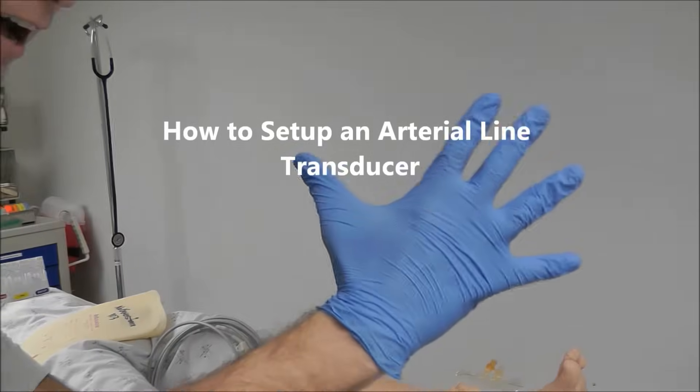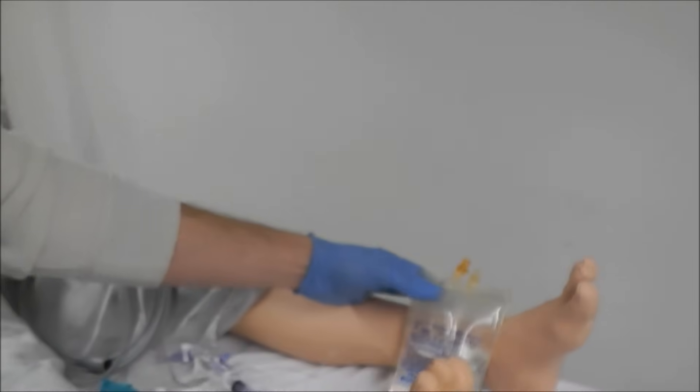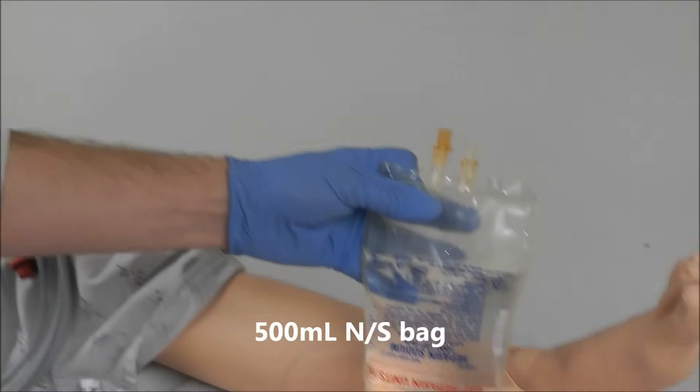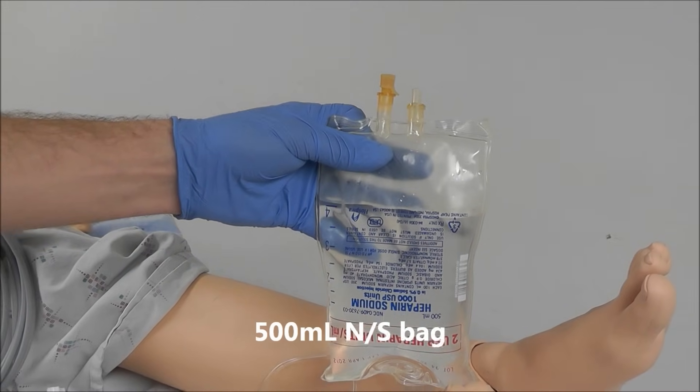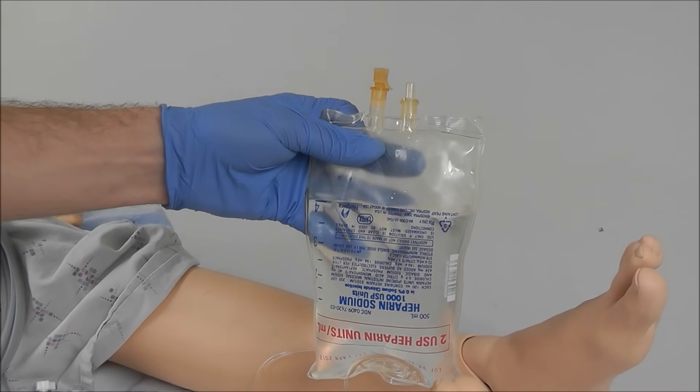Let's look at the five things we're going to need when we're setting up an arterial line. Number one is you're going to need a 500cc bag of saline or heparinized saline.